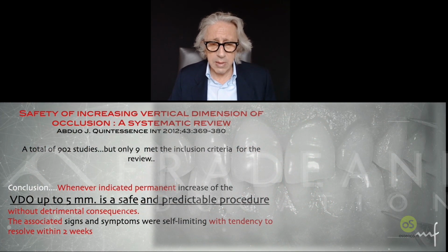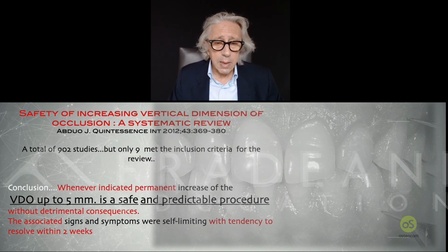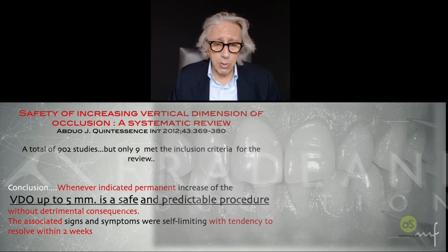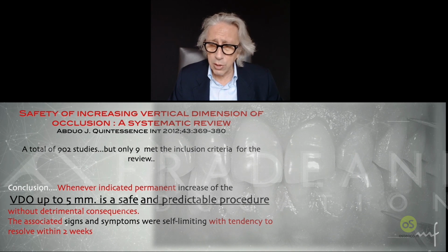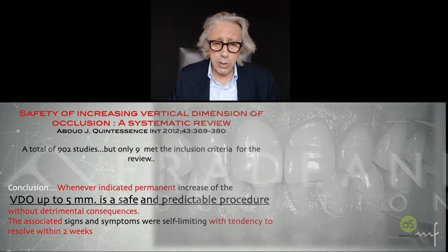Remember that we can increase the VDO in a very easy way, actually, and up to 5 millimeters seems to be a really safe and predictable procedure, according to this article by Abduo published in 2012, among more than 902 studies. And actually, the associated signs and symptoms were self-limiting, with the tendency to resolve within a couple of weeks.